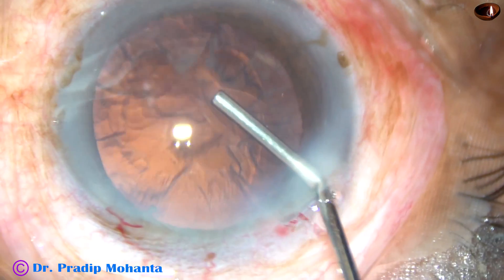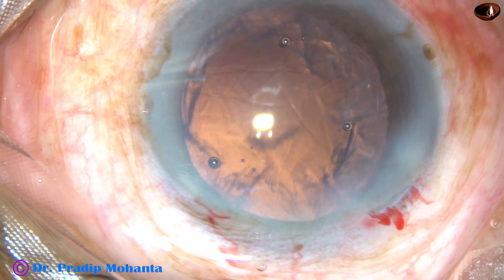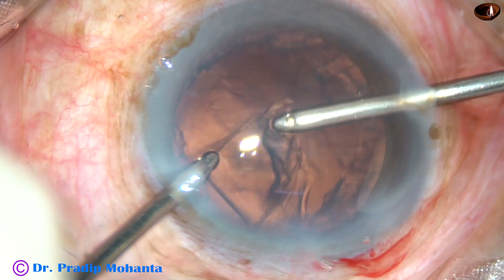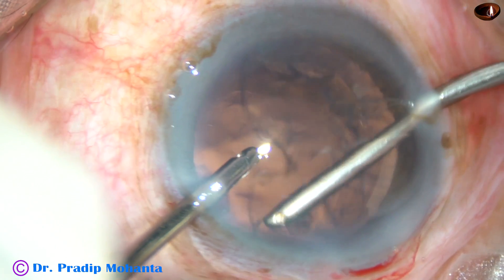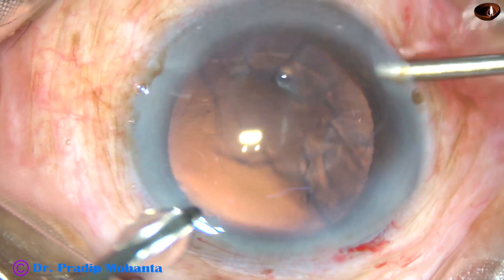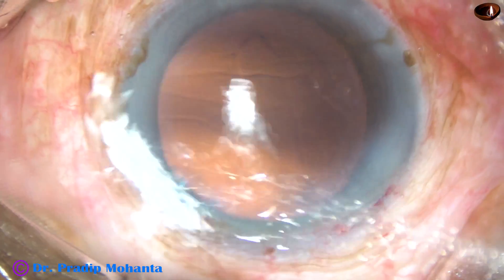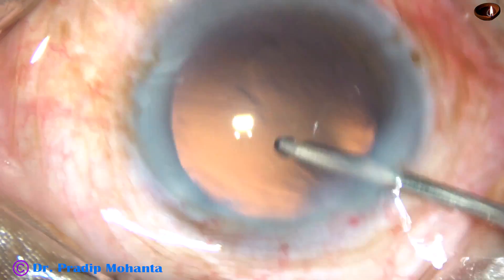Now viscoelastic substance is injected into the anterior chamber. And now this is bimanual irrigation-aspiration. Irrigation is from the left and aspiration from the right. Now I change hands. The rest of the lens matter is removed. Very little cortical matter is there on the posterior capsule in this case. A little bit of hydropolish is done.